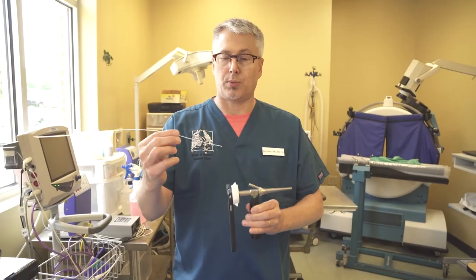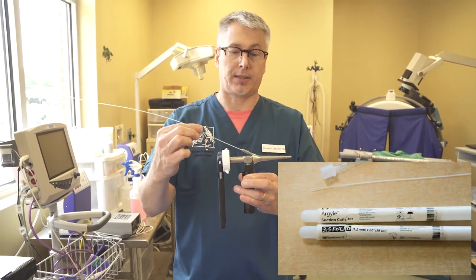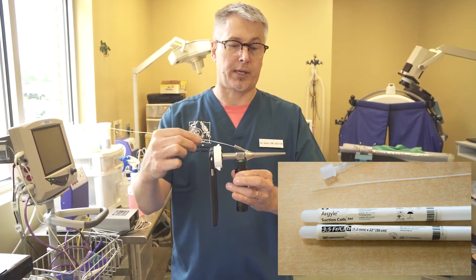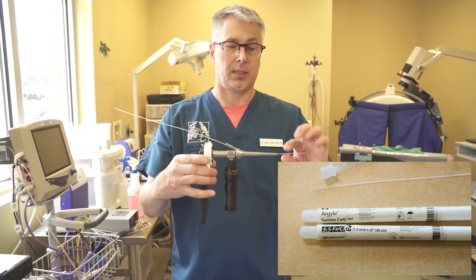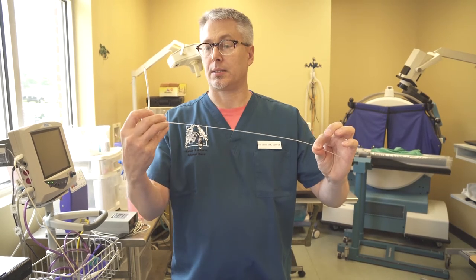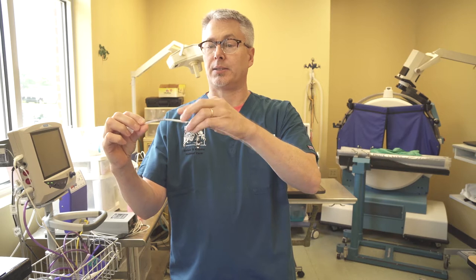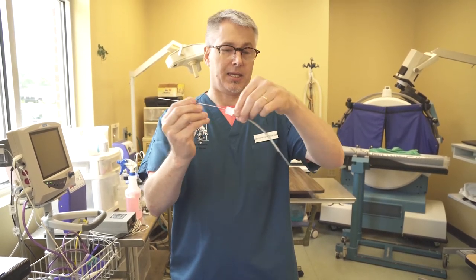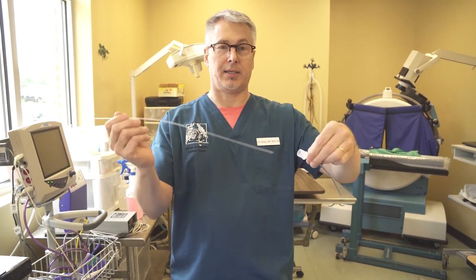Using the video otoscope, we will pass a 3½ or 5 French length of polypropylene suction catheter down the working channel and then into the rabbit's glottis. Then we will remove the scope and place an endotracheal tube over the guide — over our suction catheter guide — down to the rabbit's glottis, and then intubate.